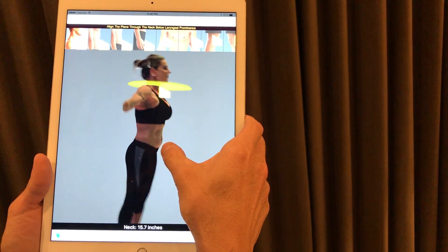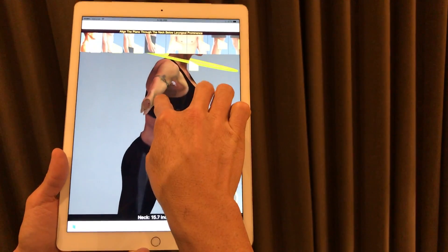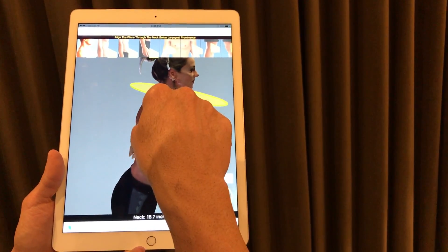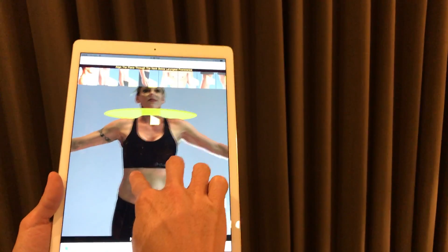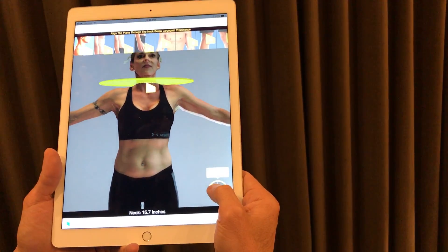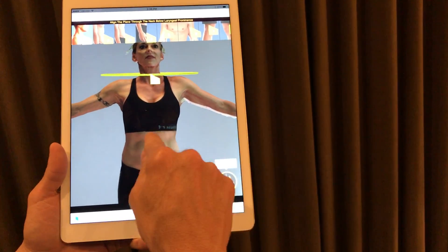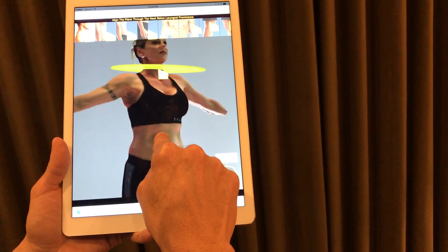If I turn this area you can see that I'm taking her shoulder. So if I zoom in with two fingers and drag down, you can hold your finger here and just simply tilt the device towards you. Now if you look through here you can see that we're getting the correct plane of that area.